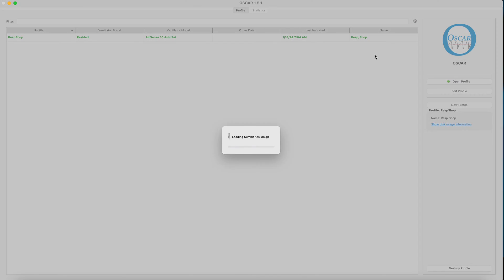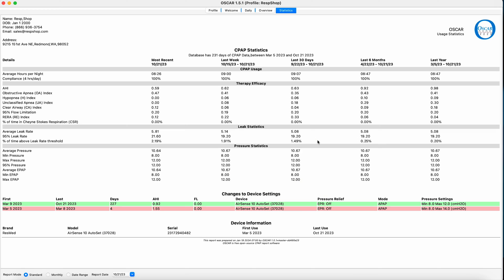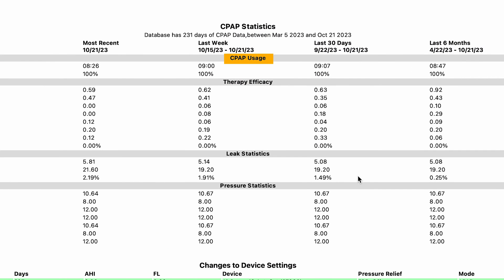Right, so with your profile set up, it's time to look at the three icons on the right-hand side that will be active. The one furthest to the right brings up the statistics window. In here, you will find two panels. The top panel summarizes some core statistics in the following groups: Usage, efficacy, leak stats, and pressure settings.